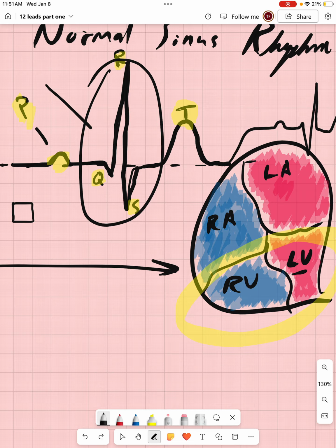It is going to take place in this spot, in our QRS. What I mean is this same time frame. So when our ventricles are depolarizing, at that same time our atria is repolarizing, but we're not visually seeing what that looks like because of how much space the QRS complex takes up.